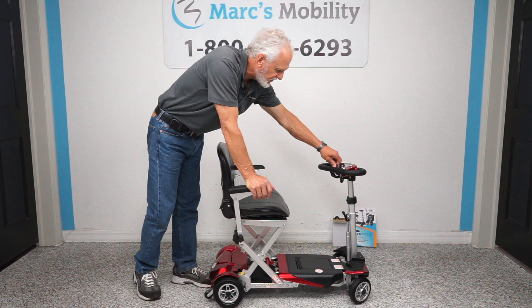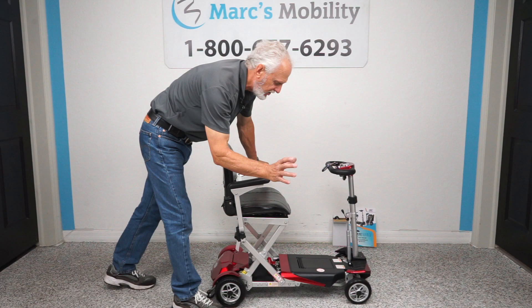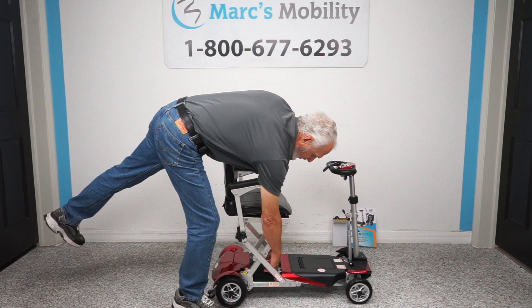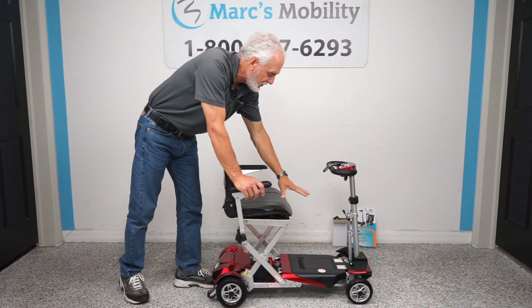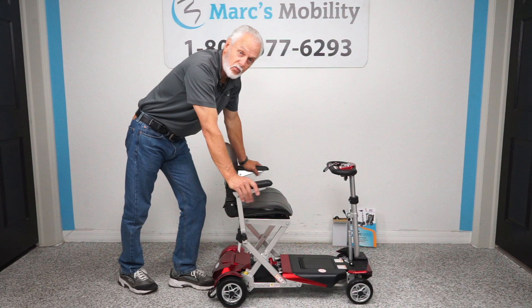You have a horn, a speed knob to adjust your speed, and a key fob that comes with your scooter. If you take the battery out and want to charge it in your house, you can order a docking device. You also have a manual lever here if you had to fold it up manually without the remote — if the battery was dead or you had an issue, you can always fold it manually. The transformer comes in four different colors: red, blue, yellow, and black.